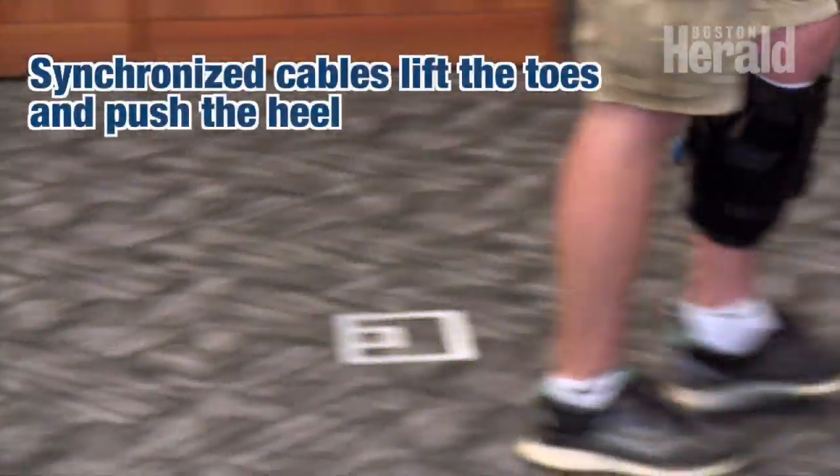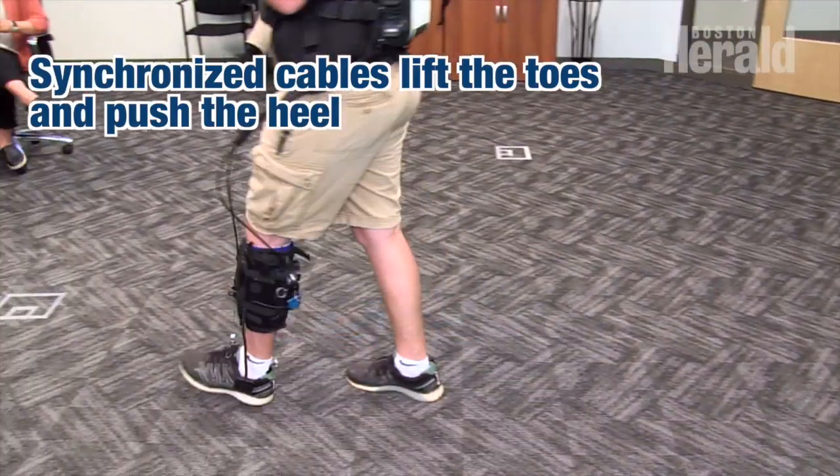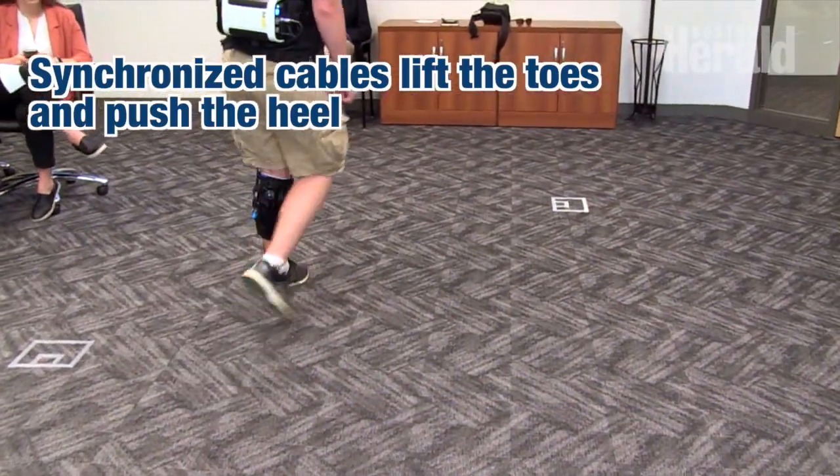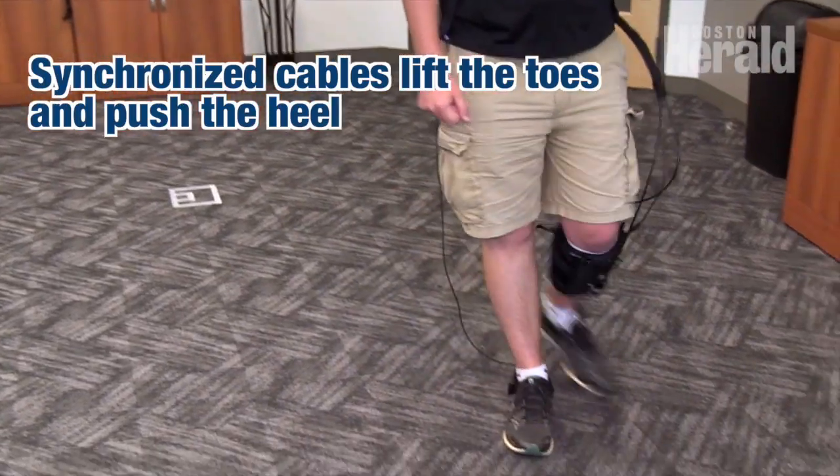You'll see that every time his left toes are meant to be lifting up, the front cable is contracting, and every time that heel is in a position where it should be pushing off to propel himself forward, the back cable will contract.